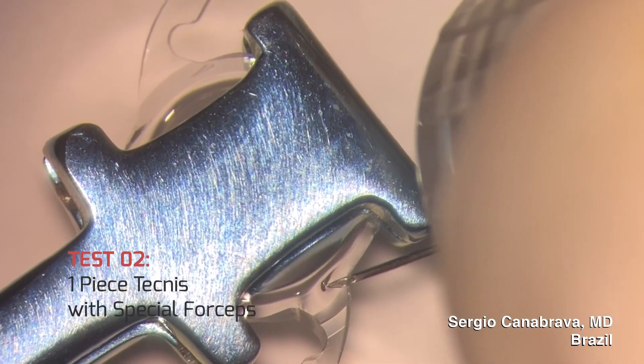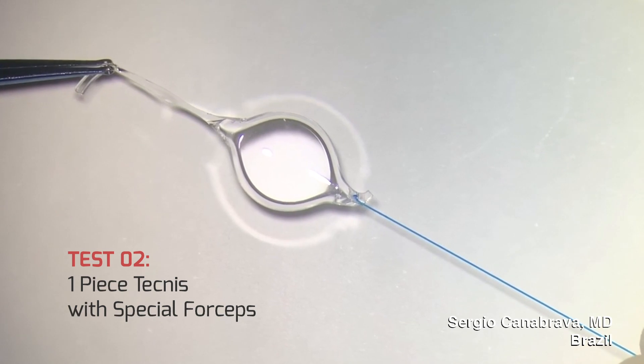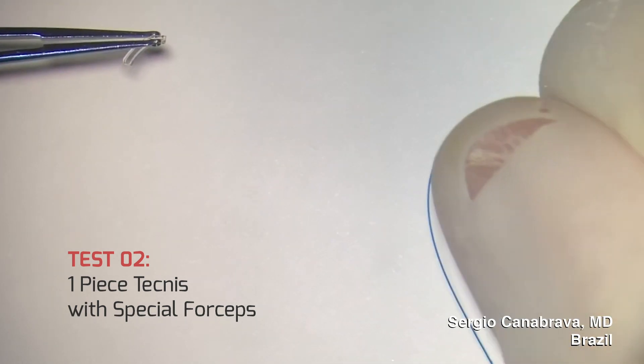On test number two, we created a special device to assist us with the punching of the horizontal hole. We tested stability and durability. Observe how the flange proline is still stable in the hole.